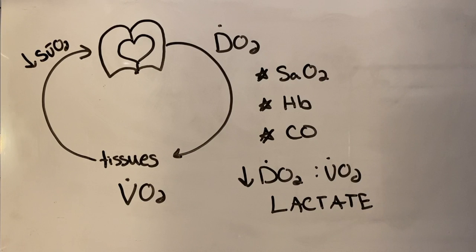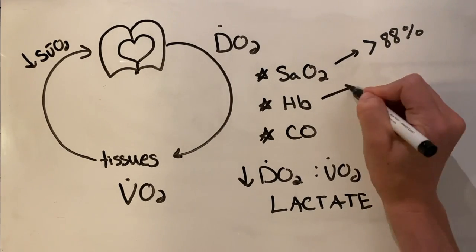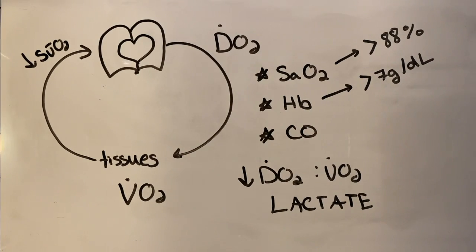As with standard ARDS management, the goal arterial oxygen saturation is greater than 88% with hemoglobin greater than 7. However, sometimes, despite optimization of ECMO support, we need to accept a lower oxygen saturation goal on ECMO in order to facilitate de-escalation of ventilator settings to avoid ventilator-induced lung injury. Close monitoring of end organ function is essential to determine if the SpO2 and hemoglobin goals are high enough.